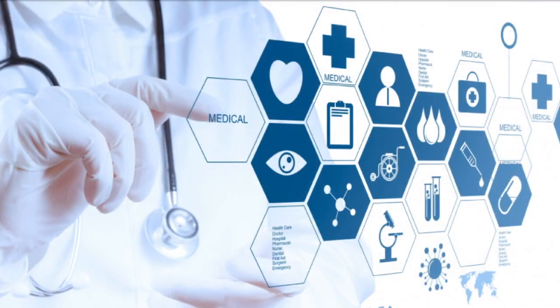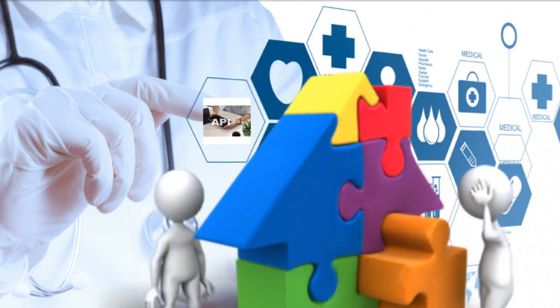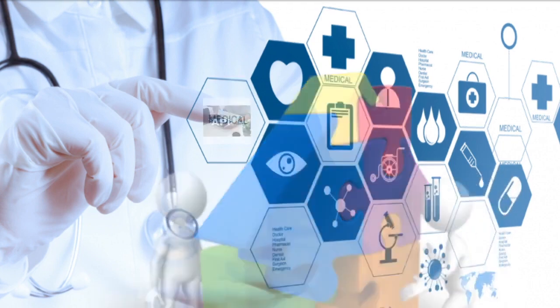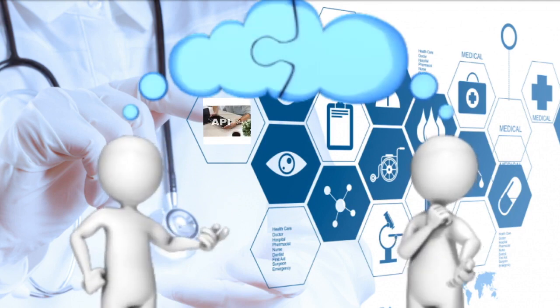Smart Health One-on-One offers public APIs enabling data to be pushed and pulled from our platform to others seamlessly. We understand the importance of the transfer of information, and there isn't any additional charge for this service. Every feature that has been shown to you in this pre-recorded webinar is attached to APIs, so if you can dream it, we can provide it to you.